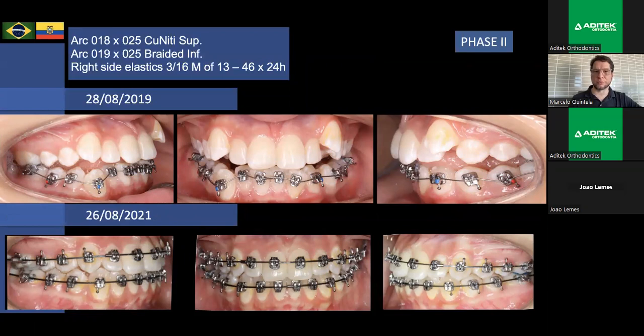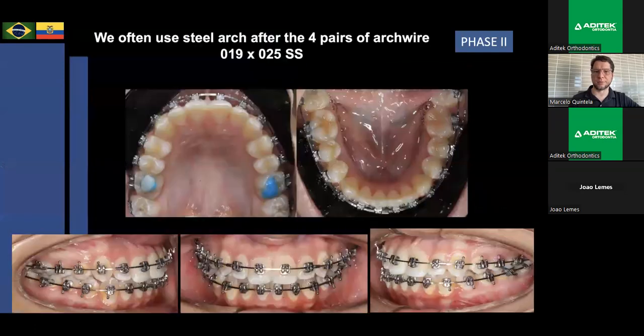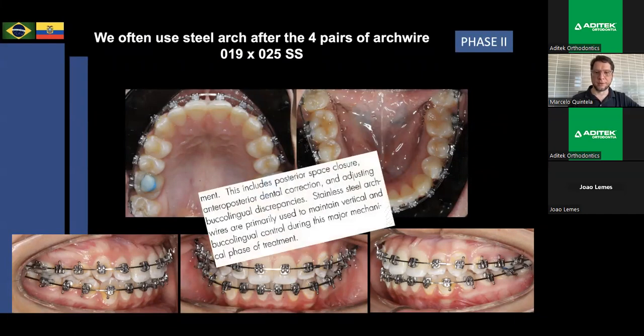So phase 2 with rectangular arcs. In phase 2, we often use steel archwire after the 4 pairs of nickel-titanium archwire. Here, the steel arc. And the importance of the steel arc: this includes posterior space closure, anterior-posterior dental correction, adjusting buccal-lingual discrepancy, the torque.